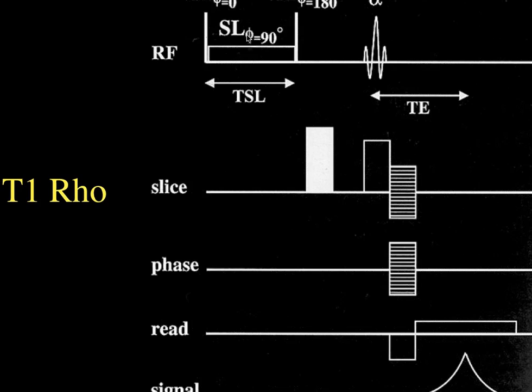So it tends to not be very important when you're dealing with water or just very small molecules, but it may tell us something about large macromolecules like fat or proteoglycans. So T1-Rho right now, people are experimenting and evaluating articular cartilage primarily. There are correlations, as we talked about in the cartilage section, between T1-Rho and the amount of proteoglycan in cartilage.